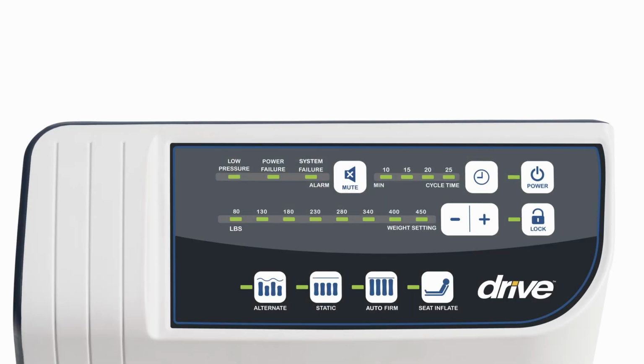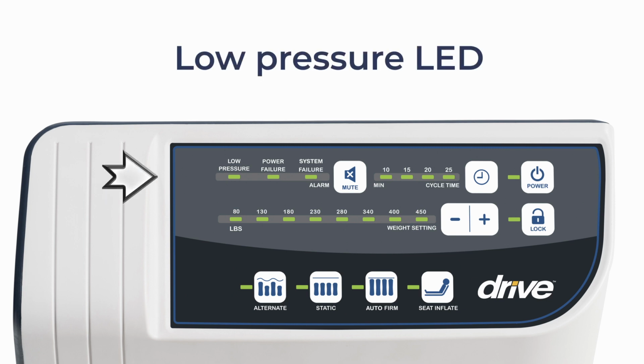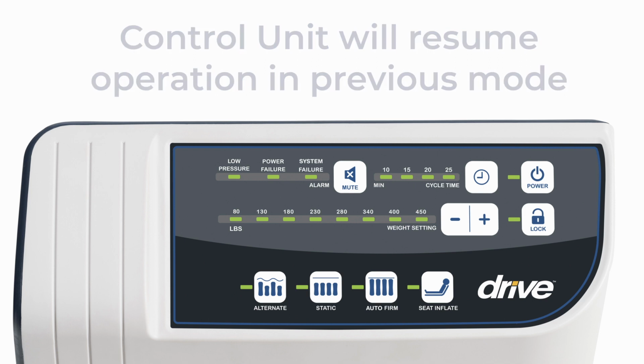Sometimes things go wrong, and an alarm will sound and illuminate. There's a mute button so you don't have to listen to the alarm while you troubleshoot. And troubleshooting with the Preserve Tech MedAire Edge system is very easy. A low-pressure LED indicator will light up and the low-pressure alarm will activate if the Easy Lock connector becomes disconnected. Once the low-pressure problem is resolved, the control unit will resume operation in the previously set mode.